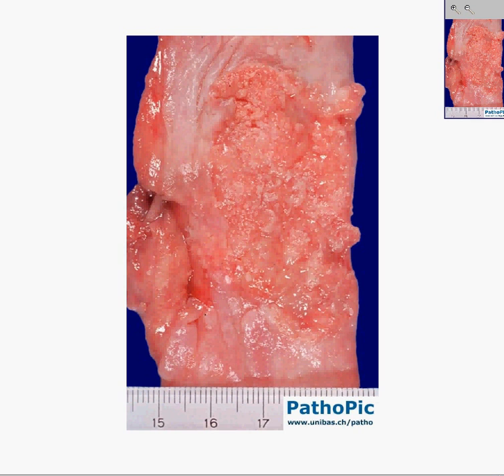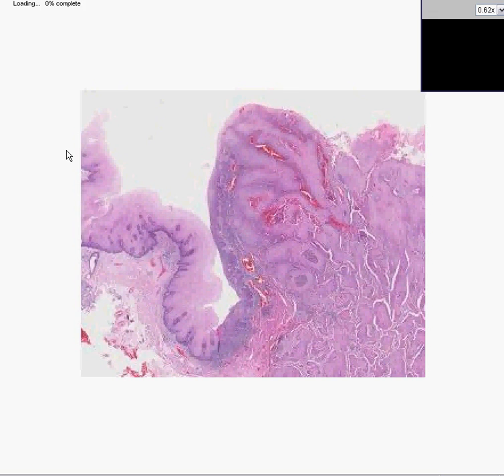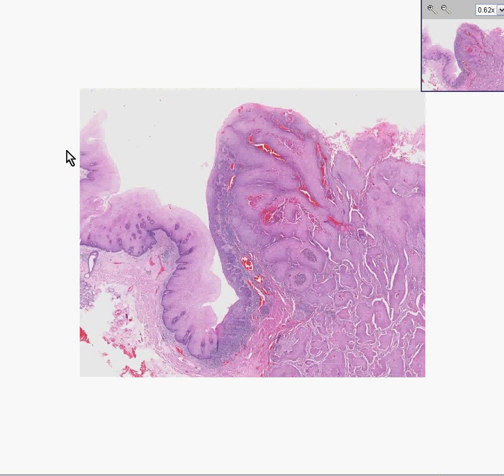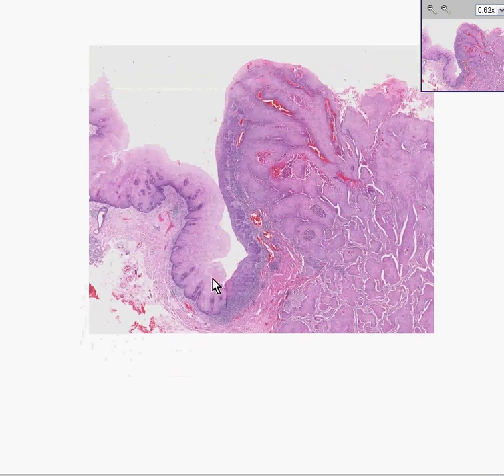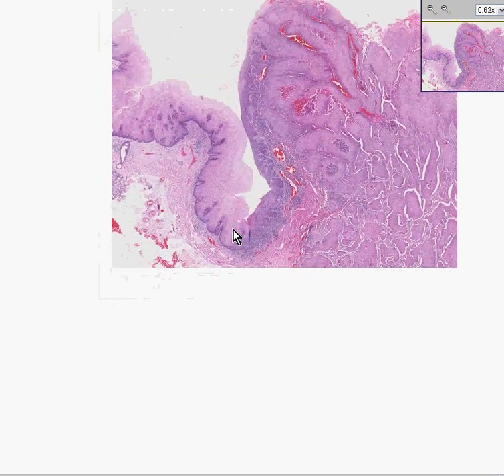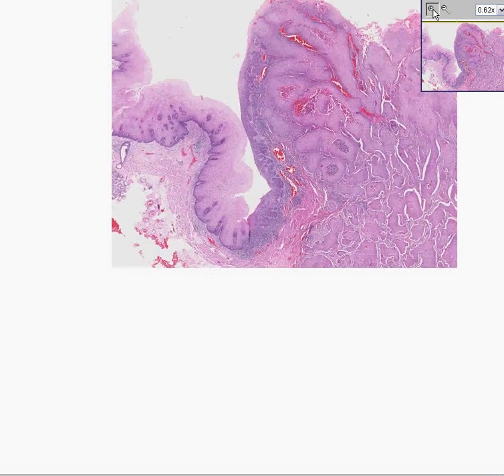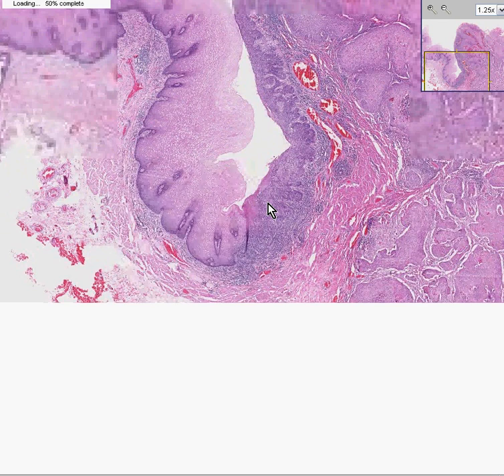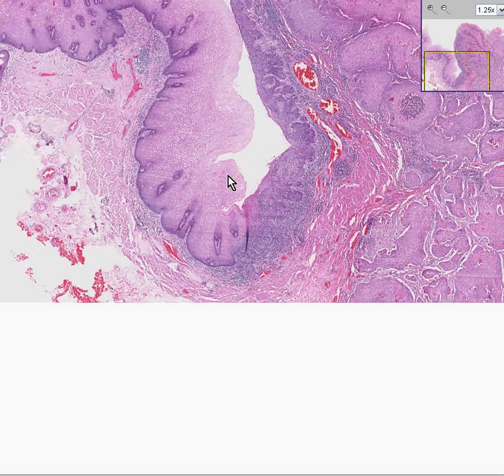Because the normal mucosal lining of the esophagus is squamous, you would guess that most of the primary carcinomas of the esophagus are squamous cell carcinomas. And you would guess right, because they are.